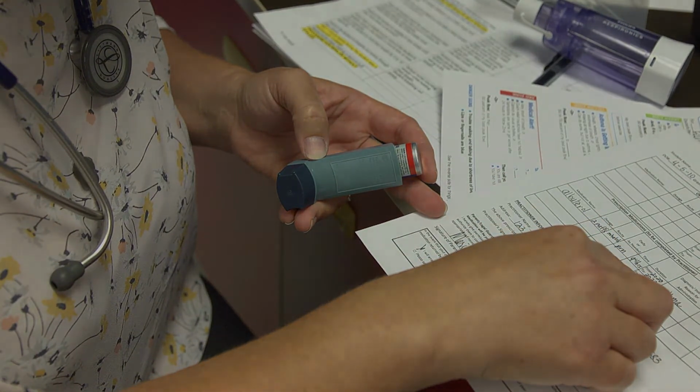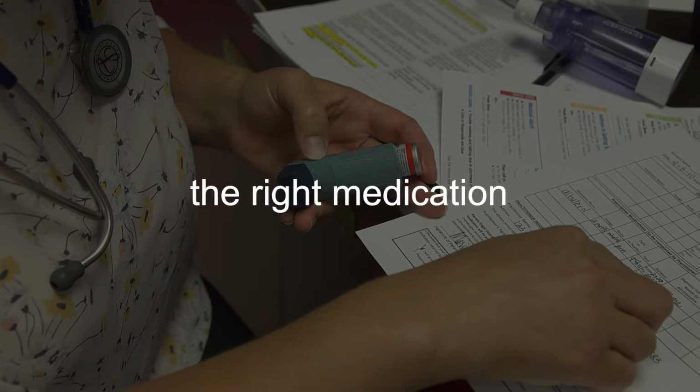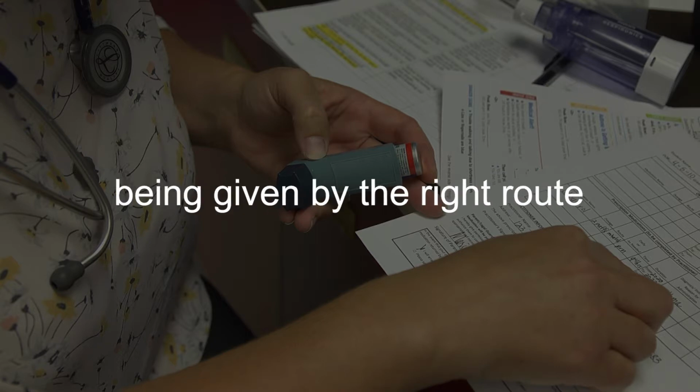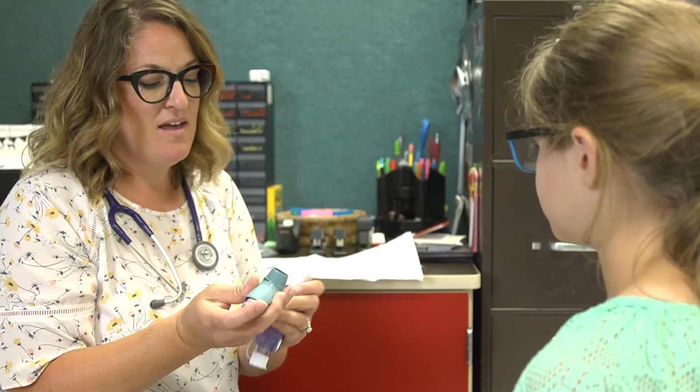Check for the albuterol and order to be sure it is for the right child, the right medication, the right dose, being given at the right time, being given by the right route. Be sure to check the medication to ensure that it has not expired. Make sure the inhaler and spacer are free of foreign objects.